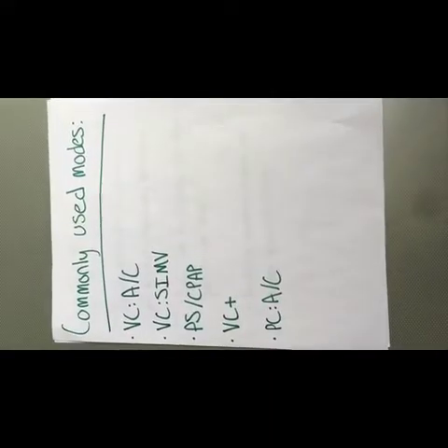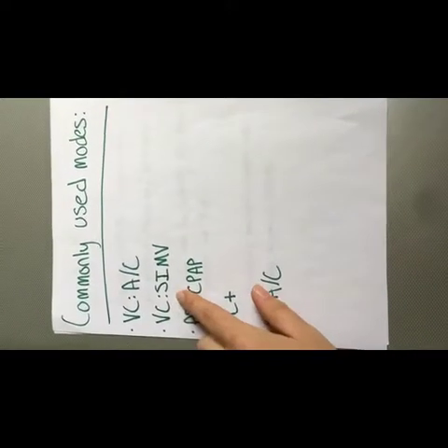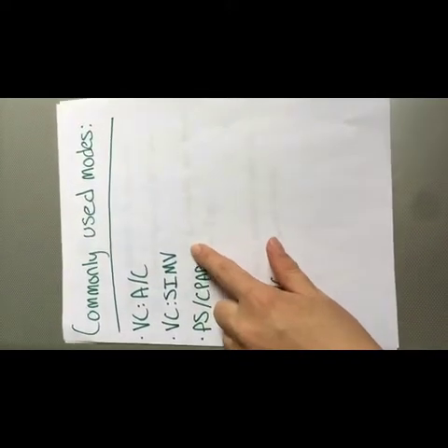The next mode we're going to talk about is SIMV, or Synchronized Intermittent Mandatory Ventilation. We're not going to spend a lot of time on this mode because it's not as commonly used as it once was. In fact, according to studies highlighted in Chest magazine, the poorest weaning outcomes are associated with SIMV.